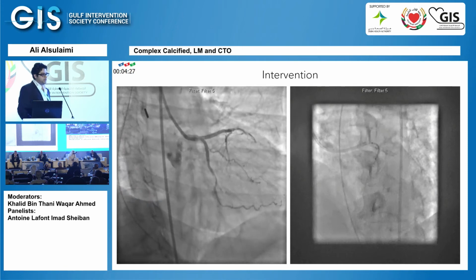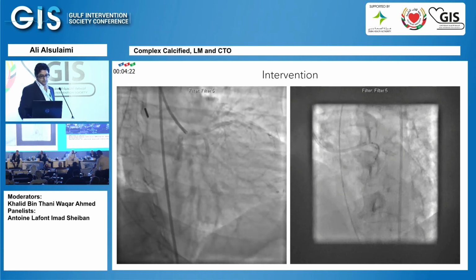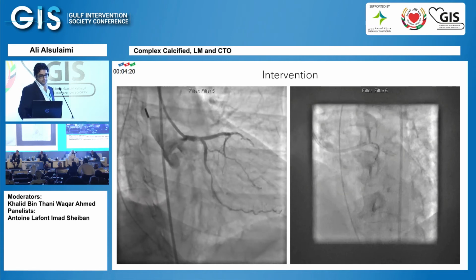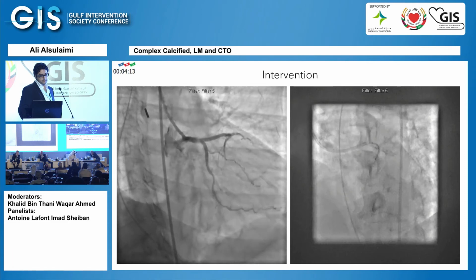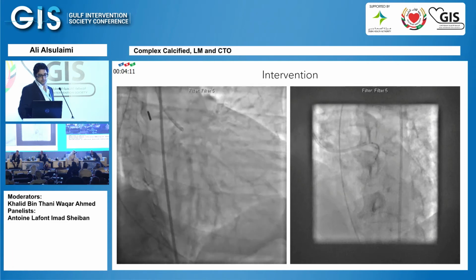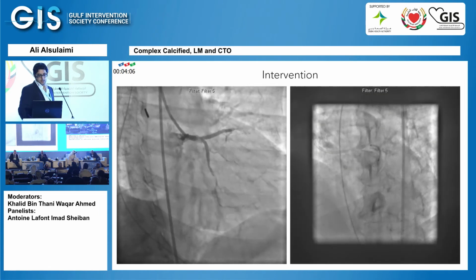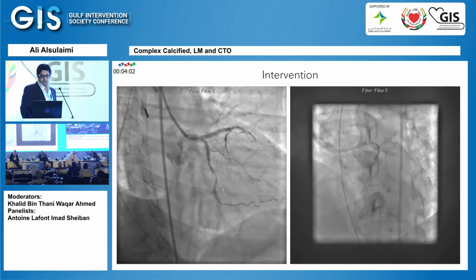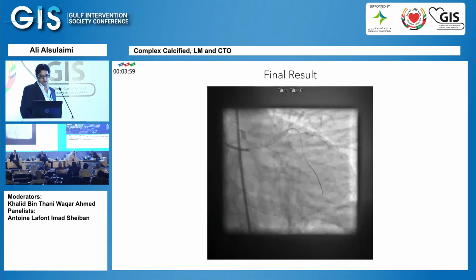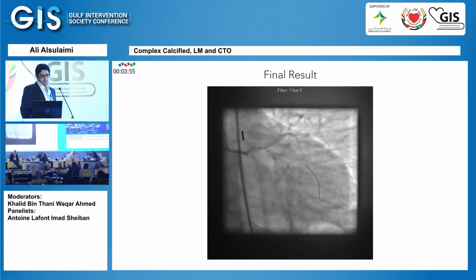This case took 7 hours. We were very determined to help this lady go through this. And you can see that the left main stent is actually deformed, heavily deformed. And what we ended up doing at this point, when we thought the wire was gone, we wired both vessels again, and we had to put a new stent in the left main. So this is the new stent in the left main, and this is the result at the end.